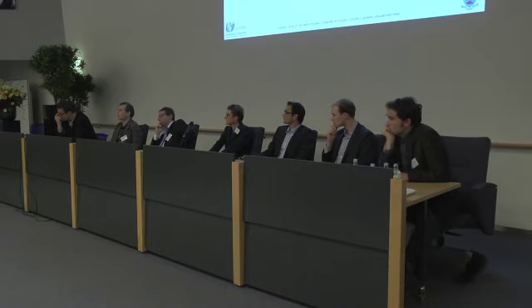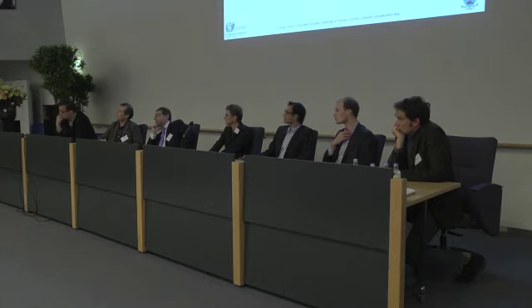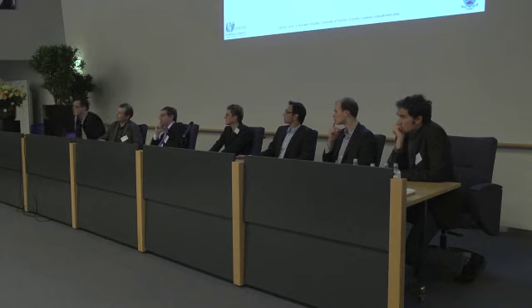I'd like to know if you've seen similar problems and how you solve them. Because Dr. Lehtinen showed that you just set up a 2-second apnea alarm. That would be almost impractical for us to foresee in NAVA, because then we would have NAVA PS switched on automatically. And the last question is that in your presentation you showed very low tidal volumes on the screens. They ranged between 1 ml and 2 ml. So are they really that low, or is it just a matter of measurement?